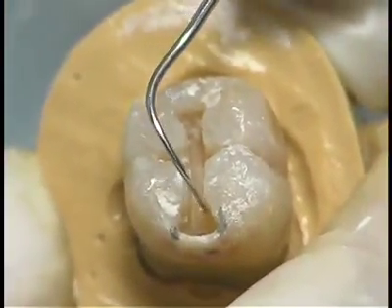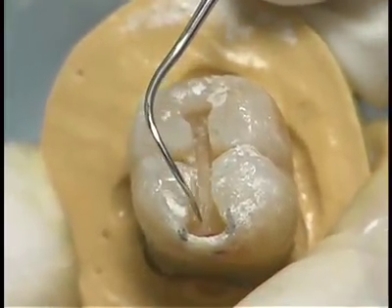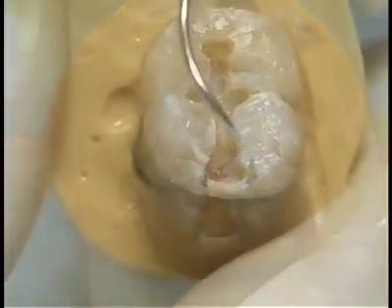The carious lesion can be seen at the dentino-enamel junction. We can see the carious lesion now because the enamel has been removed.